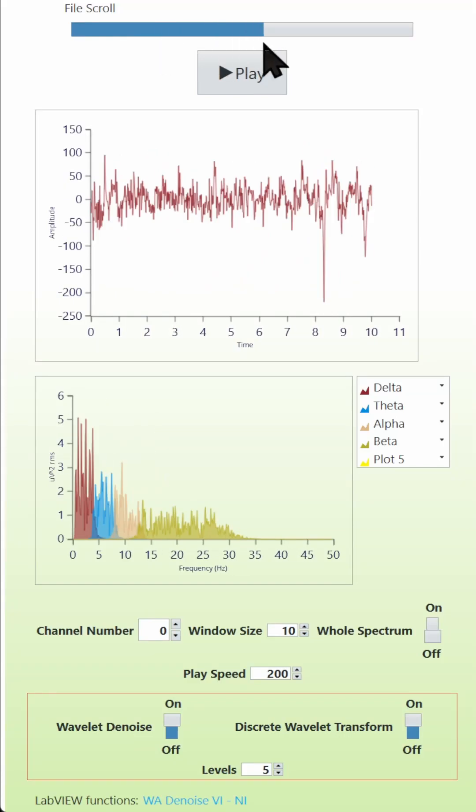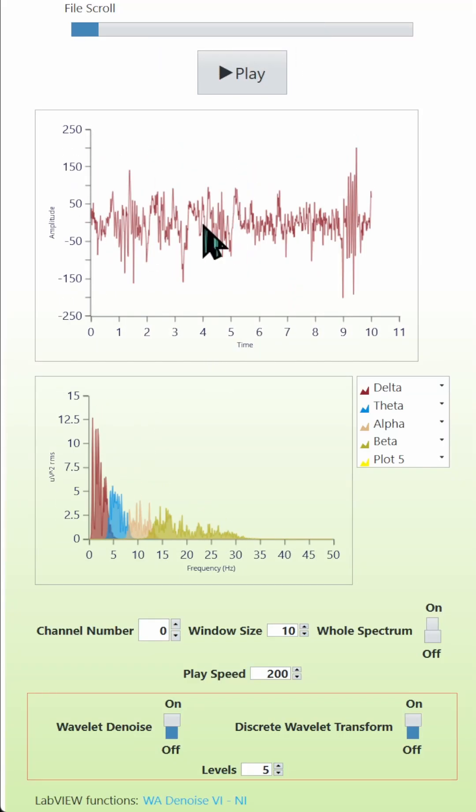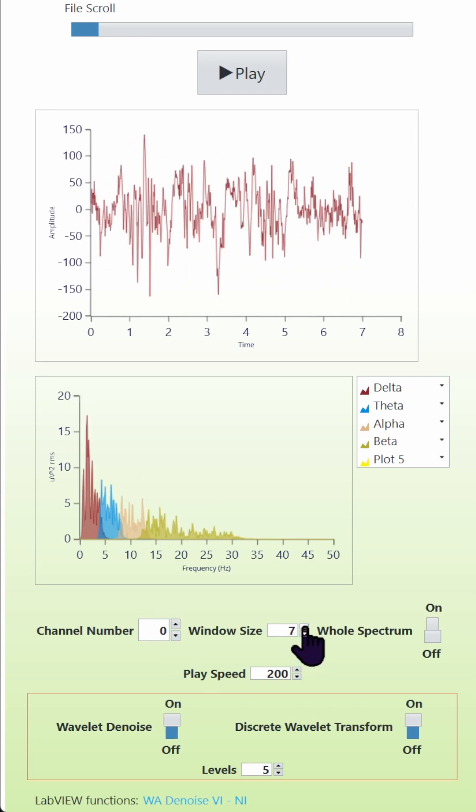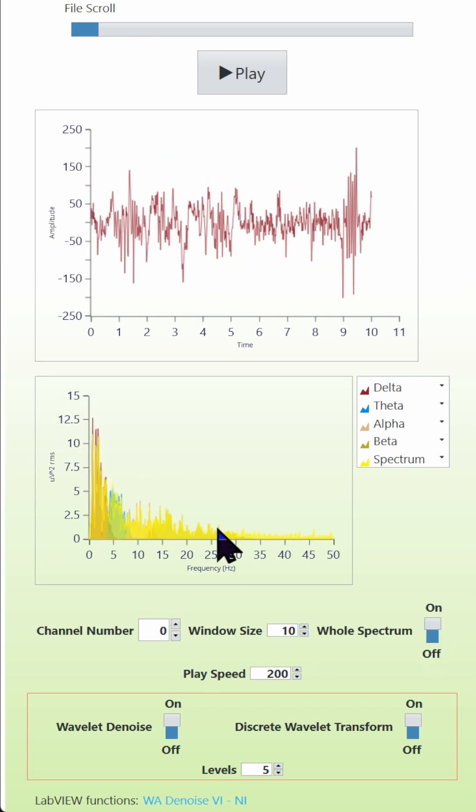As per usual, you can scroll through the file, which will show you the raw EEG and its frequency response. You can select your channel number, window size (10 is the maximum), and overlay the whole spectrum.